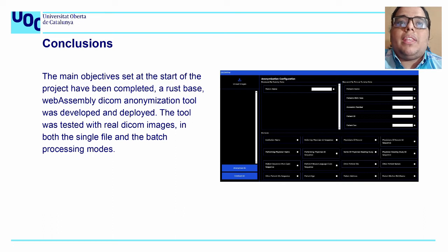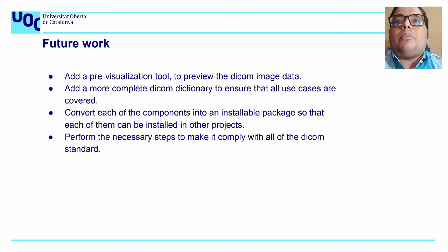Once this module was ready, there were some small changes from the mockups on the final interface, like adding a delete button to each image. And after all of this, we are able to perform the anonymization process directly in the user's browser without any installations or API calls. That can greatly improve the user experience.